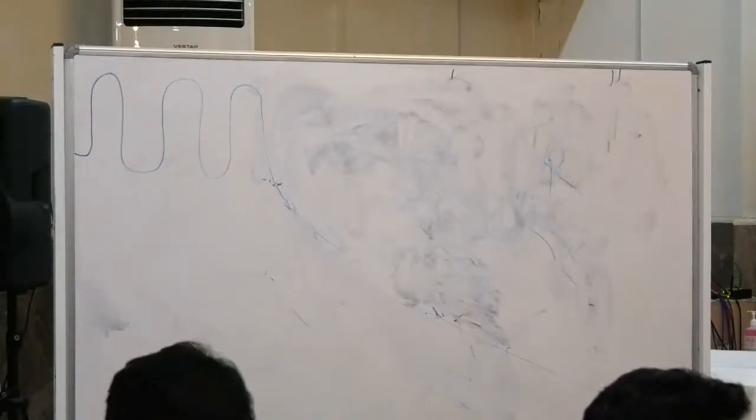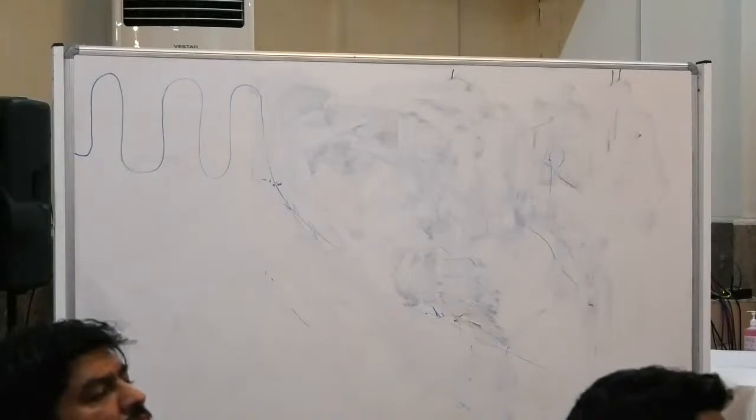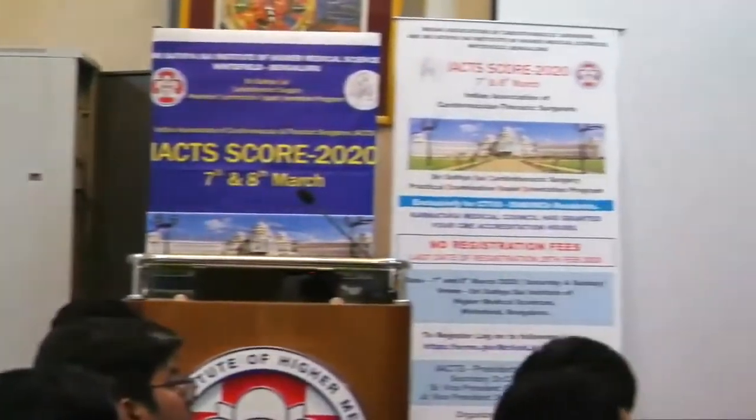Now what has happened? You check the reservoir, absolutely dry like a bowl. That will be your first loss. Fantastic. The cannula is displaced or misplaced into the RA. That's why it is minus. Remember, on bypass, RA pressure is minus. Because of siphon action, RA is totally empty, pressure is minus.